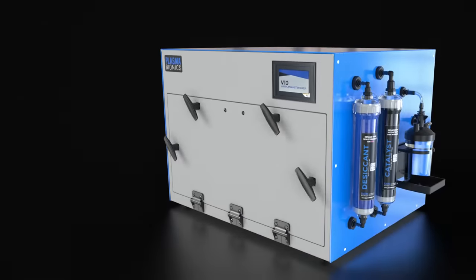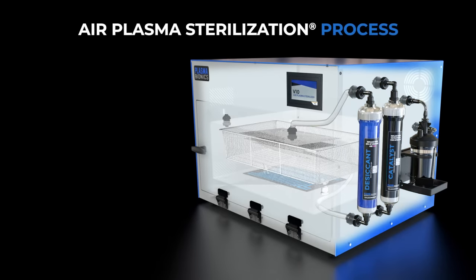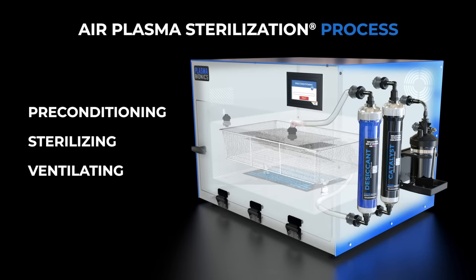The V10 Air Plasma Sterilizer is easy to operate. Simply load your instruments and begin sterilization. The three-step sterilization cycle, consisting of preconditioning, sterilizing, and ventilating, takes only four hours to complete.